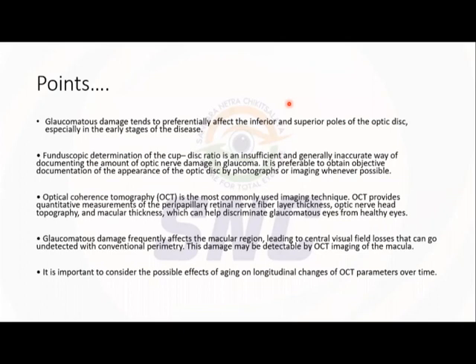Directly you should not go there. You have to see from the top whether it is a good quality index. There will be an infrared image. Is the infrared image properly taken or not? The movement of the eye can be picked up by the kinking of blood vessels over there. That you have to look for.